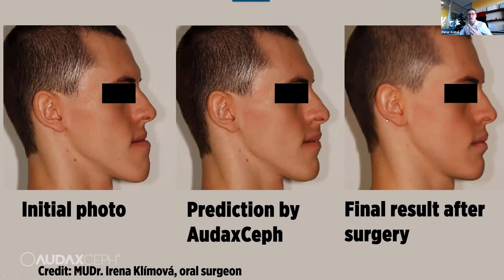I'm not encouraging you to show this to your patient. You should think about how the patient could feel if the result was not according to what the software predicted. But you can get a clue of where your treatment is heading.